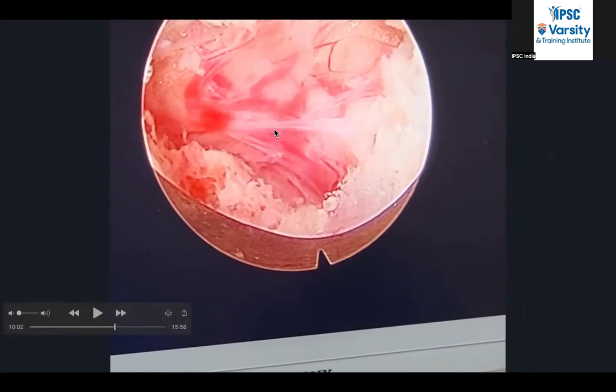And if you look at this, this is all fibrous tissue. This is what we expect, right? Whenever there's a disc herniation, we expect some fibrovascular growth which happens inside, right? This is what fibrovascular growth is. So you can see a lot of blood vessels over there, over the disc also, encroaching towards the nerve root. And that is the reason why we have radiculitis, okay? Neuritis or radiculitis, what we call. So this is the inflammation part. You can see a lot of inflammation over here. This is a fibrovascular growth which encroaches and entraps the nerve over there, and that causes severe pain.